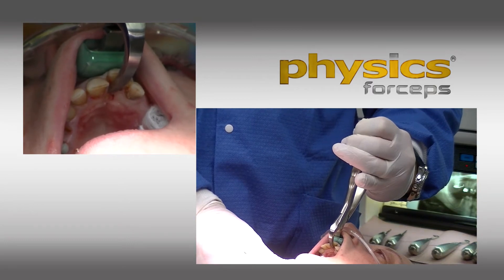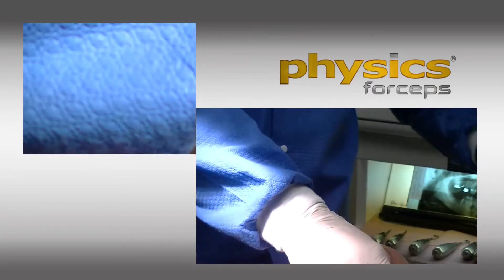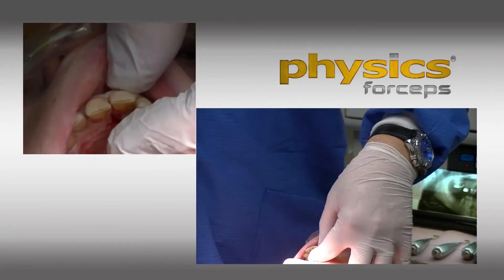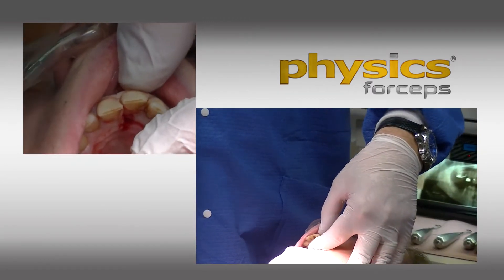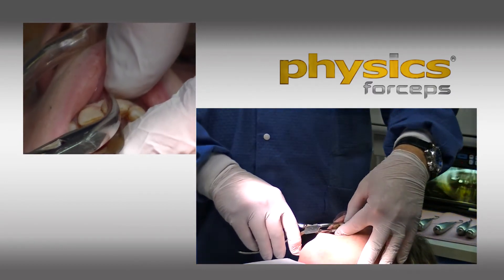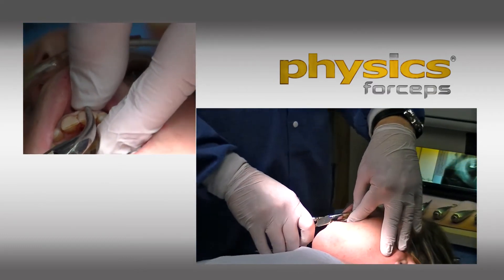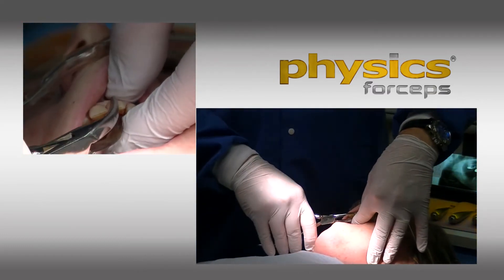The forceps is not intended to remove the tooth in total. Rather, it creates hyalinization, which simply breaks down the PDL fibers, or the septal fibers, which allows extraction. I'm also going to be placing implants in this area, so the buccal plate is very important to me.